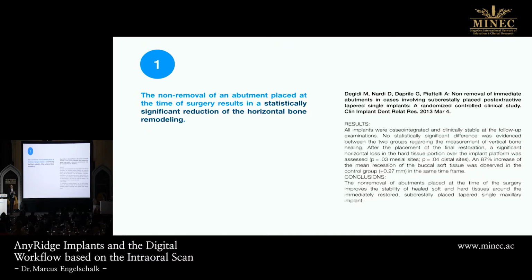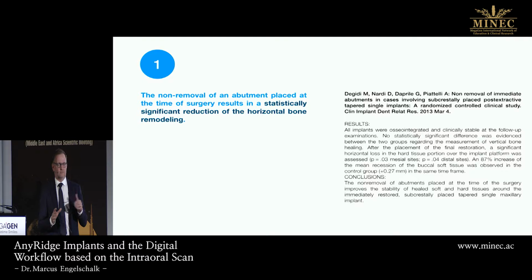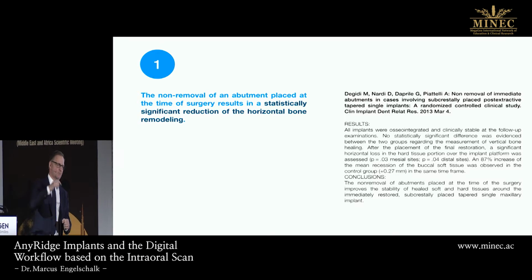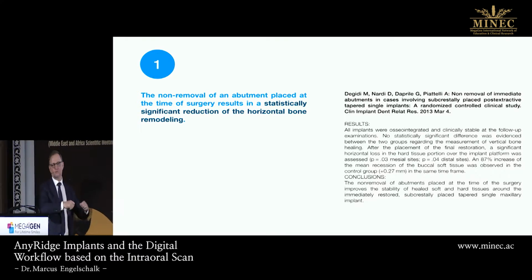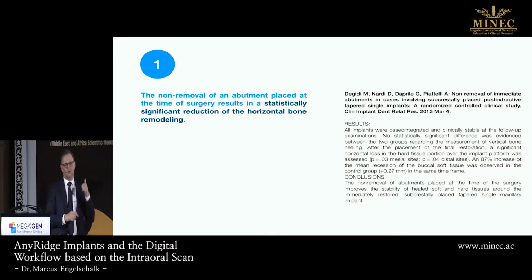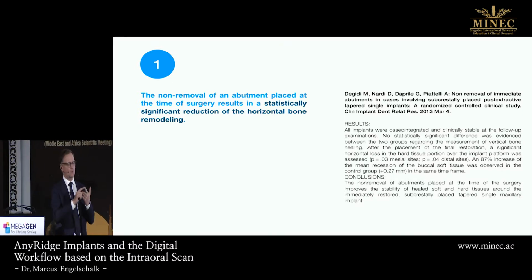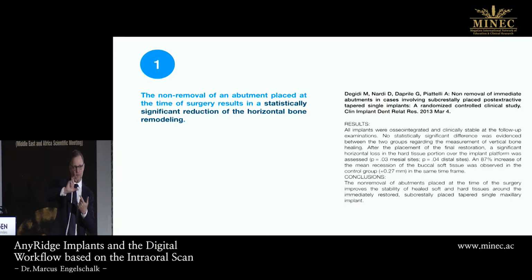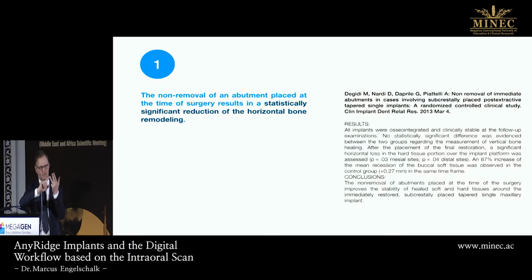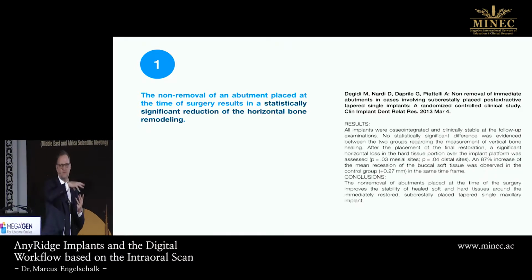So normally if I ask you, how many times do you screw an implant, you will always be wrong. So think about an implant. It's healed transgingivally, so you put in the implant, put on the healing screw, and suture it, and let it heal for some months. Then you screw off the screw, you screw in the impression coping, you screw off the impression coping, you screw in the healing cap. Okay, now you've done the impression.